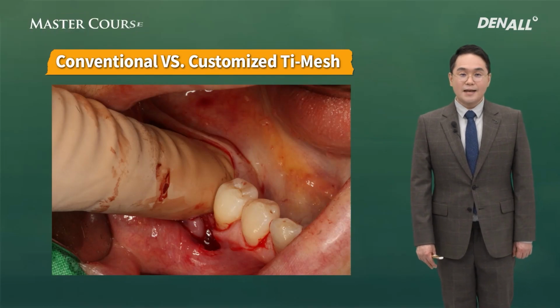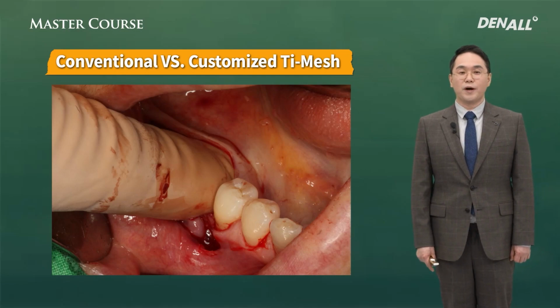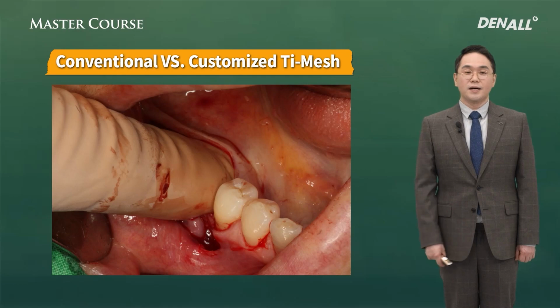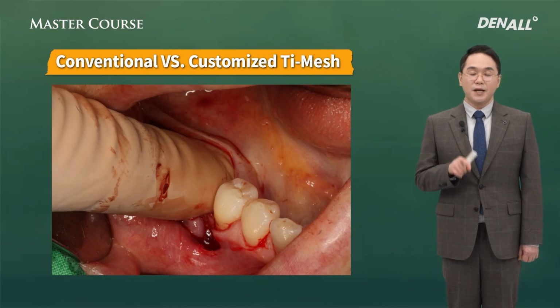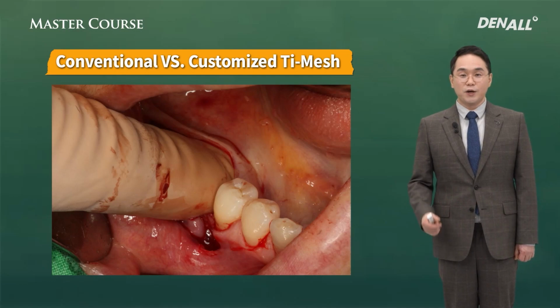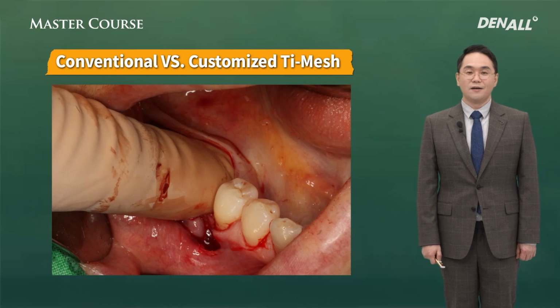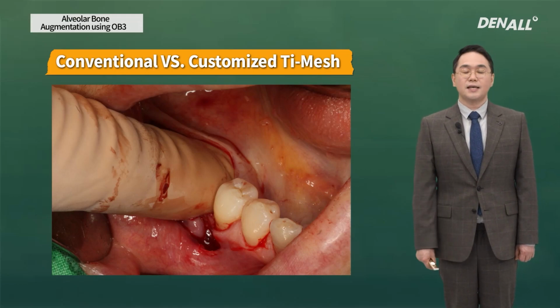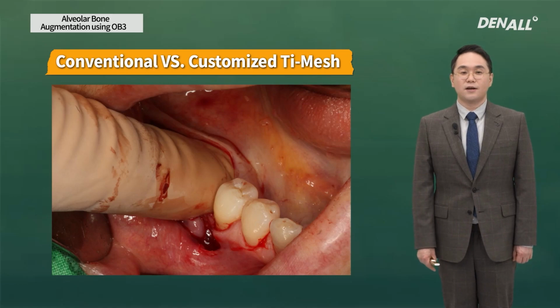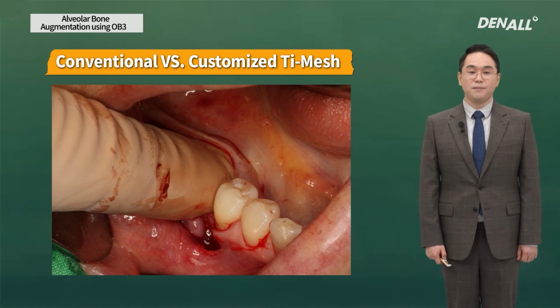According to Dr. Picos, in the mandibular posterior, not only the buccal flap but the lingual flap can be advanced coronally. Using a finger like this, you can dissect the lingual flap below the mylohyoid ridge. The lingual flap can be advanced coronally a little bit. When you do GBR for vertical augmentation in the mandible, lingual flap dissection can achieve primary closure rather easily.